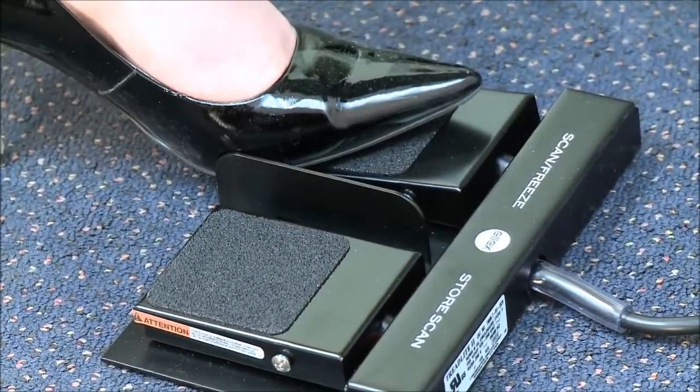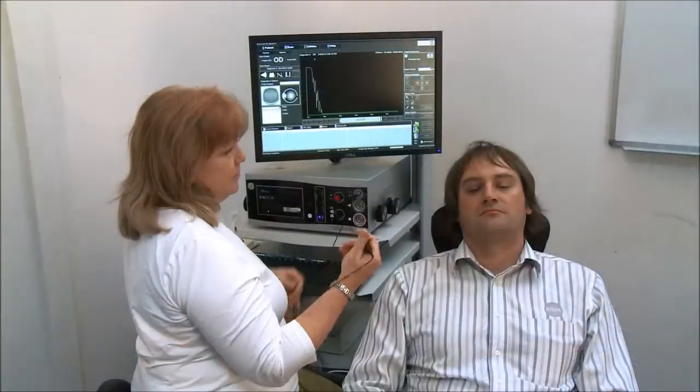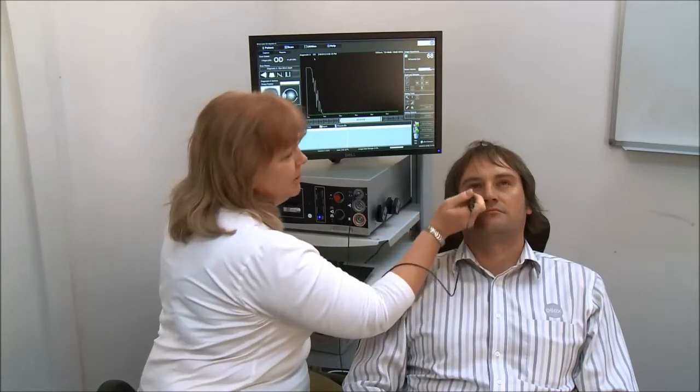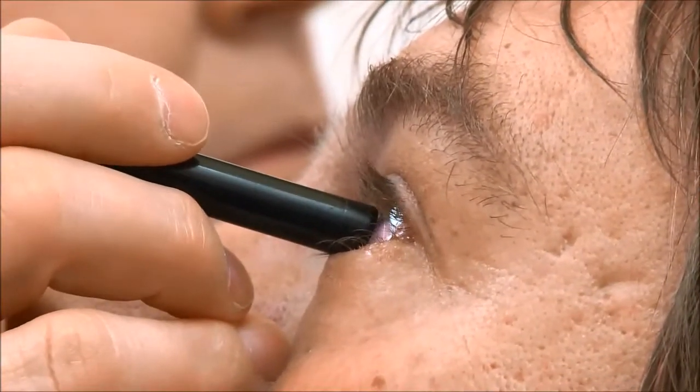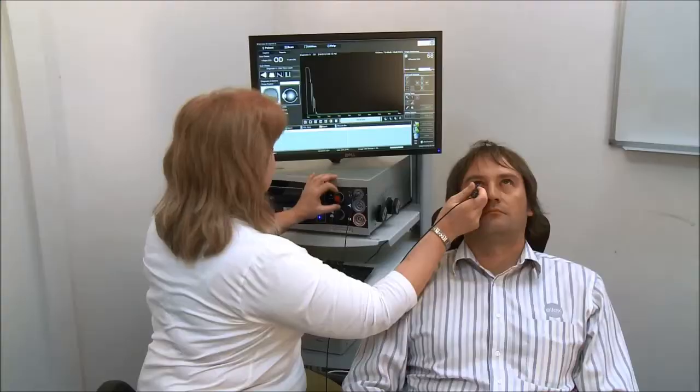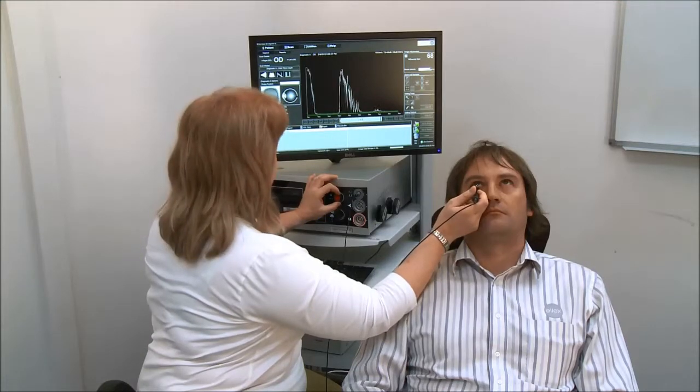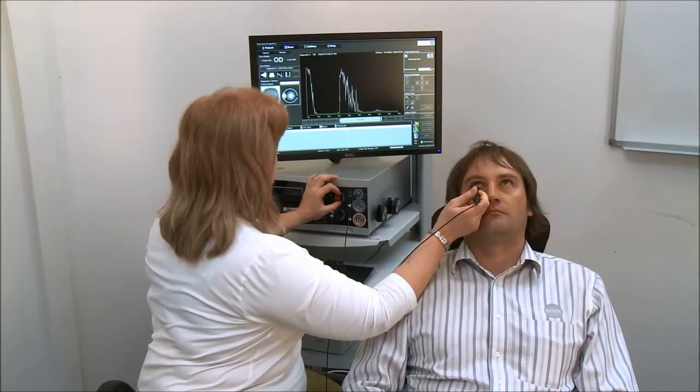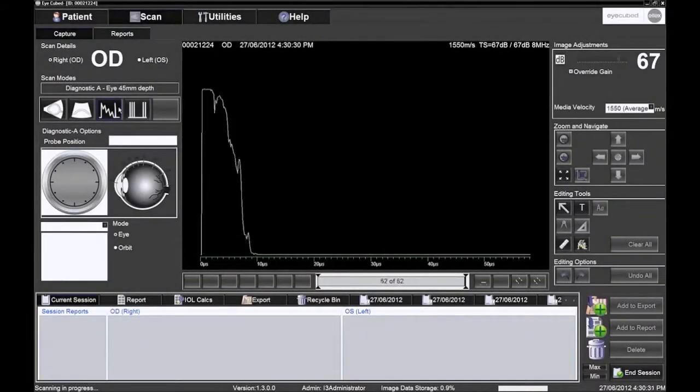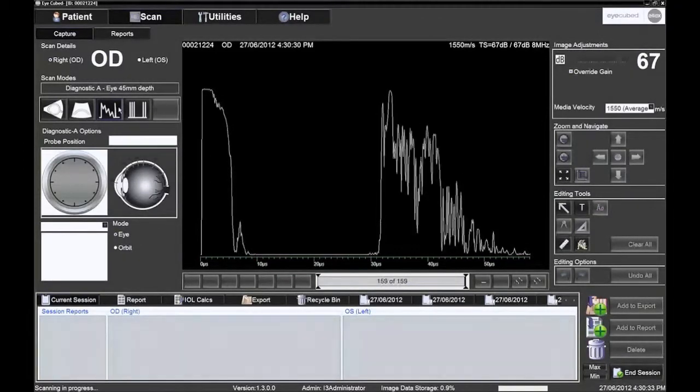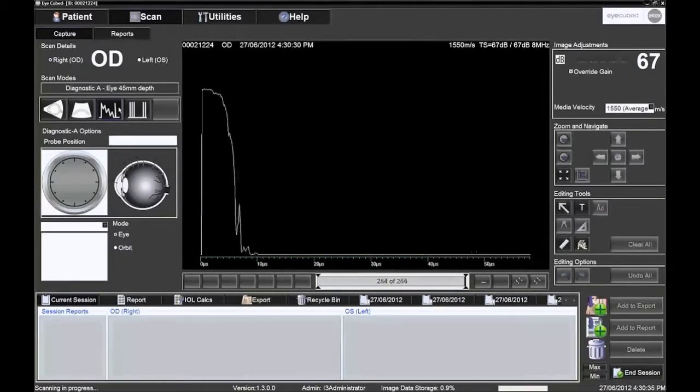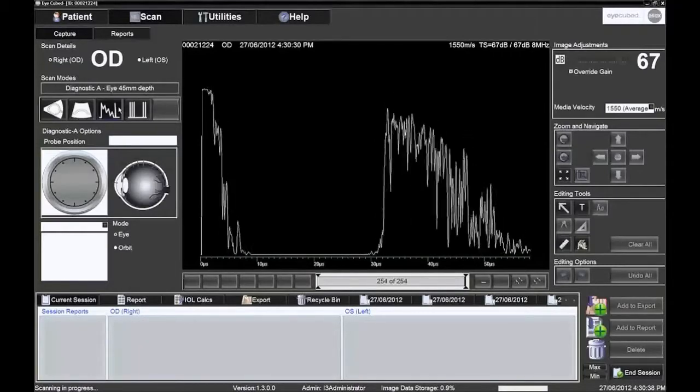Press the left foot switch or F11. The probe will be placed in contact with the limbus on the open eye. The operator can examine just the globe up to 45mm depth in the eye position or also examine the orbit, up to 70mm in depth, in the orbit position.